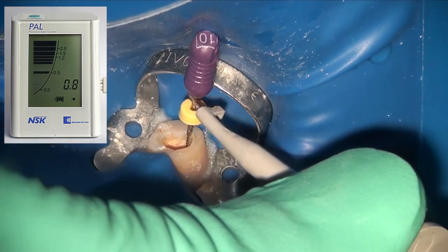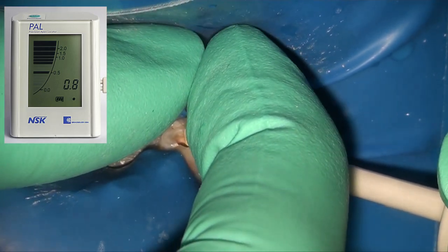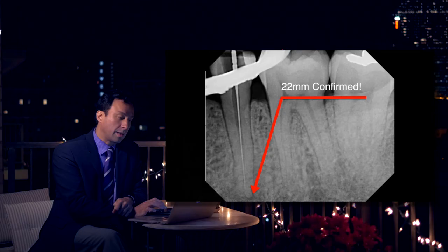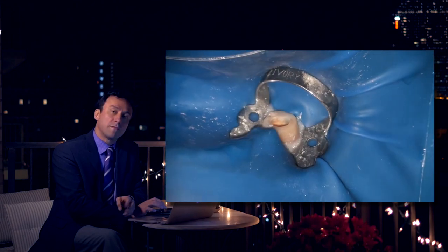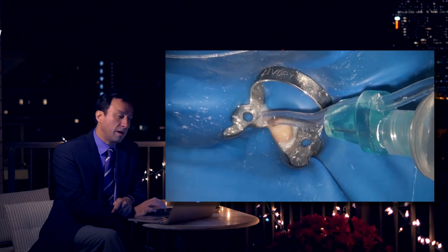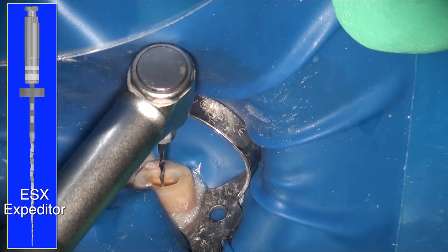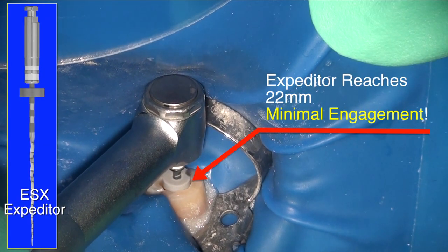At this point I'm comfortable measuring my working length. Using the PAL apex locator, I'm getting a 22mm working length. It's important to always confirm your working length with a radiograph — not just to confirm the length and accuracy of the apex locator, but also to get information about the shape of the root.